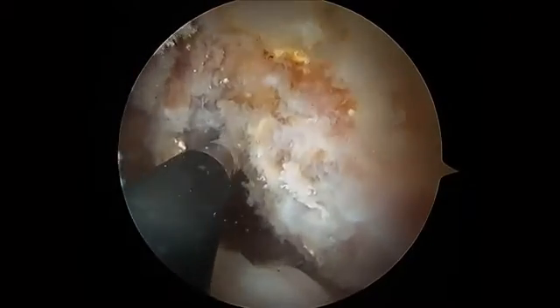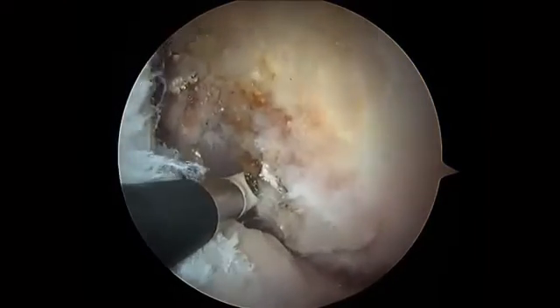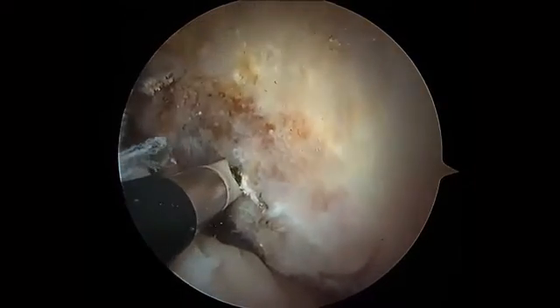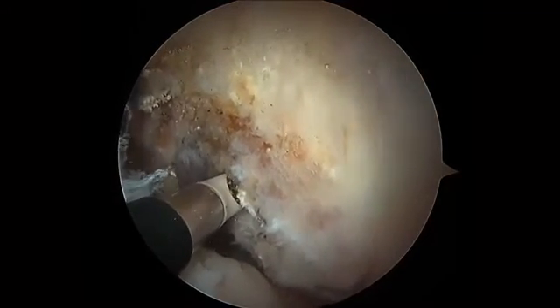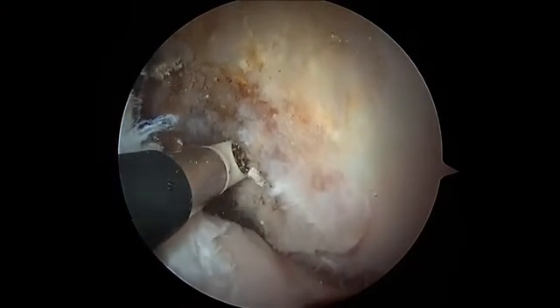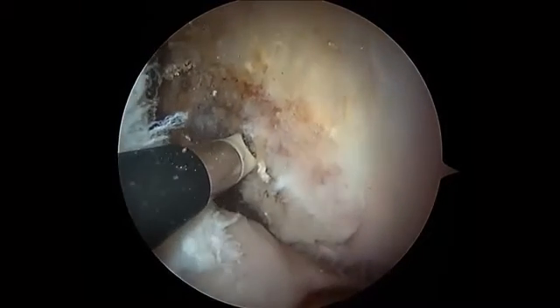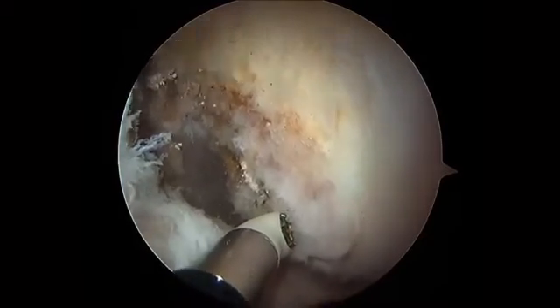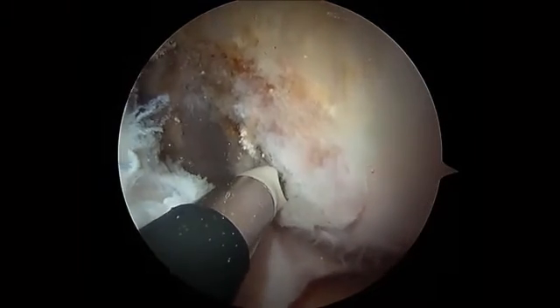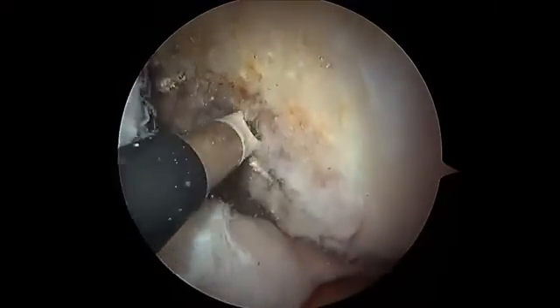This is my back wall, and I'm going to use the electric cautery to mark my spots. So this is where I want to be. Note that I'm eccentrically located in the footprint. I'm relatively high in the footprint, in the direct fibers. I'm not smack dab in the center of the footprint, which would be right here. I'm closer to the back wall, and I'm moving more towards the intercondylar ridge here, and I'm moving away from the low position, which is adjacent to and bordering on the cartilage. So I want my tunnel to encroach on the ridge. The ridge is right here.